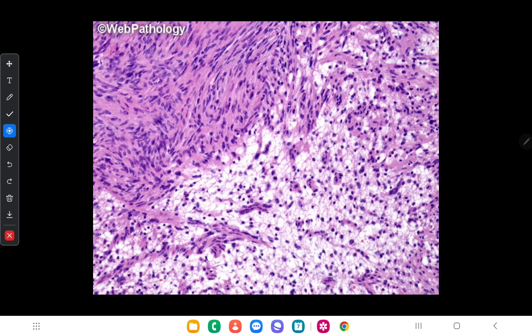Here is a microscopic view of schwannoma. In microscopy you can see there are two areas: this area is called the hypercellular area, or Antoni A area, and this area is called the hypocellular area, or Antoni B area.